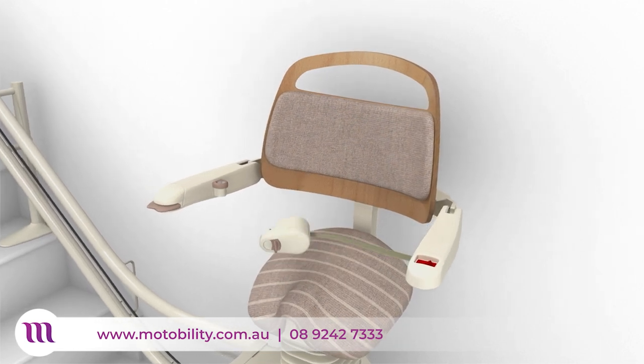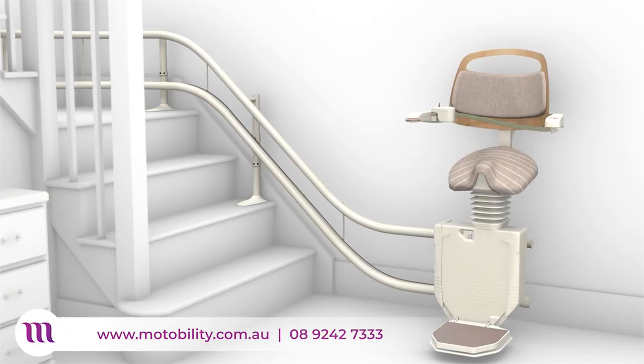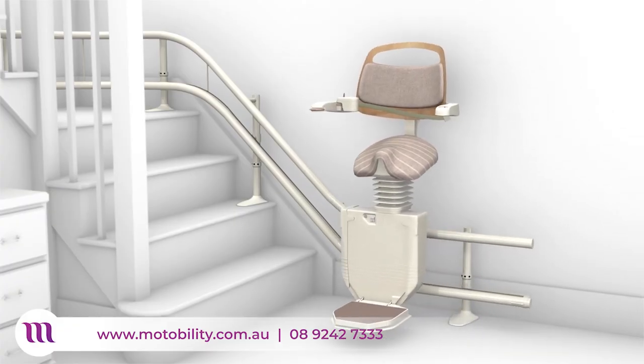Your retractable secure seat belt fastens with one hand, so it is easy on arthritic hands. The Sadler stairlift will not operate unless your seat belt is fastened.